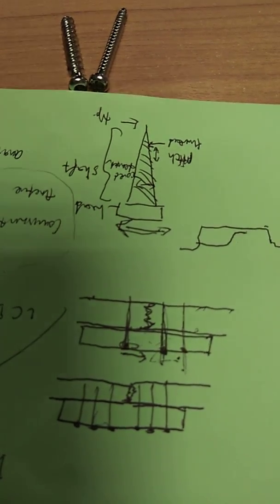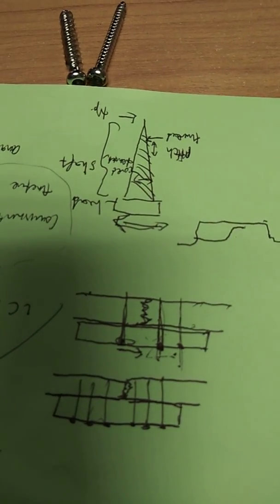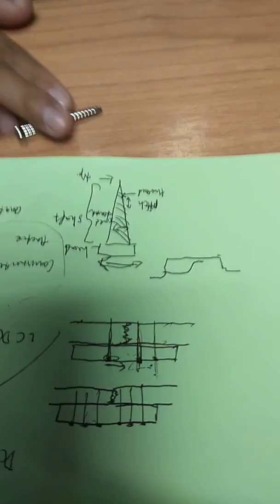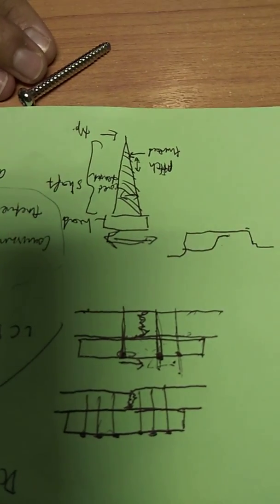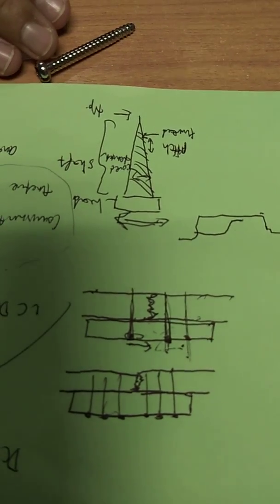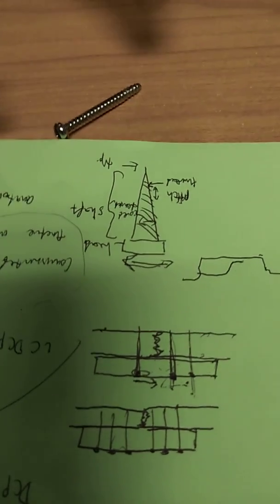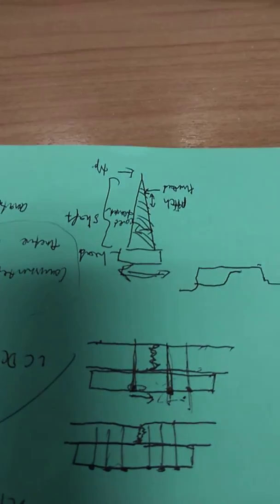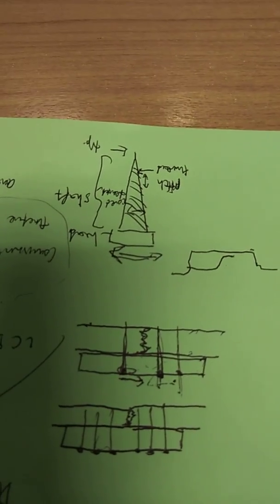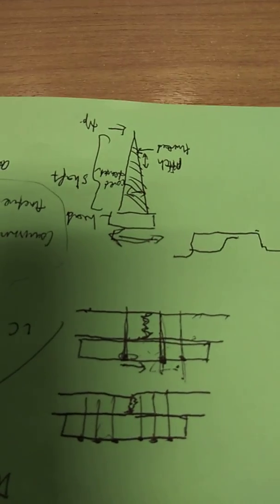Therefore, by increasing the pitch, you increase your pull-out strength. That means the strength needed for the screw to come off. So this is increasing your pull-out strength. That means it's difficult for it to come out in a less dense bone. Cortical bone is very dense, so you don't need a bigger pitch to hold it. Bigger pitch is overkill for cortical bone. Okay, so you need this for cancellous bone.